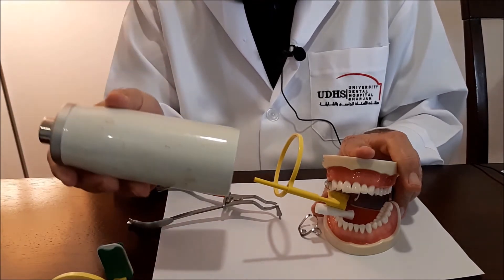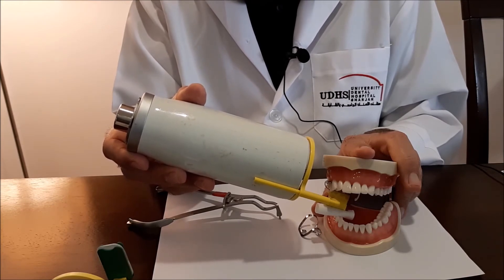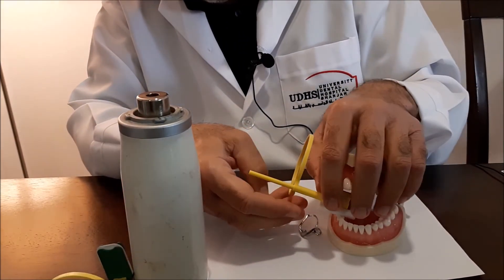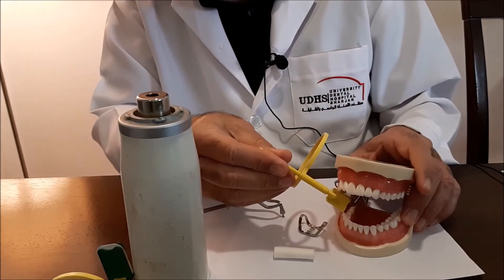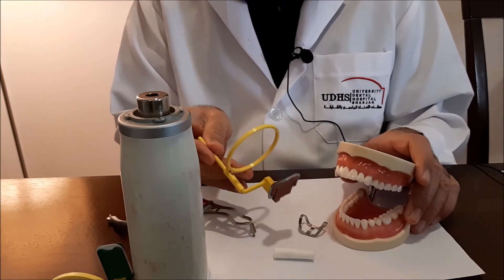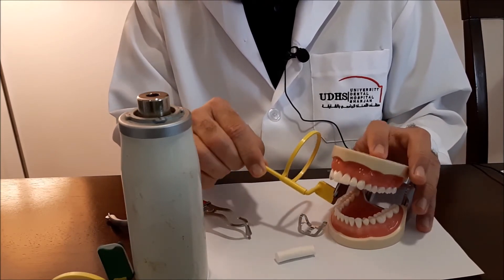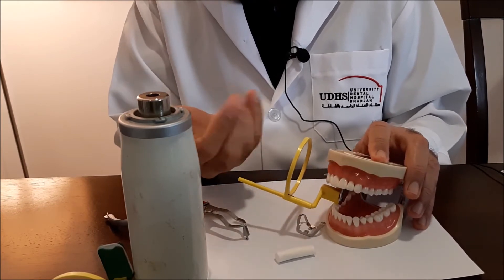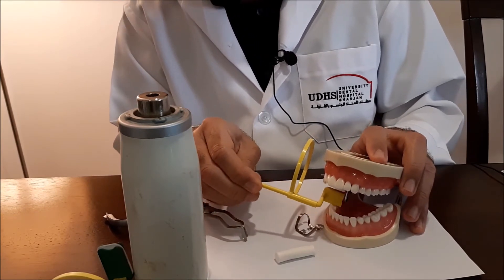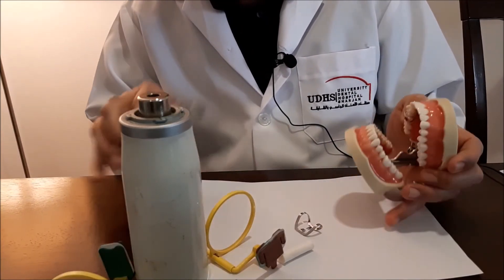The next step is to place the x-ray beam so it is in contact with the ring, then perform your exposure. When done, ask the patient to open, remove the cotton roll, and then remove the sensor holder entirely. The key point here is: to show the whole apex, don't just place the holder more toward the buccal side — always push as much as you can toward the midline to guarantee the apex will be captured. This applies to upper molars as well.